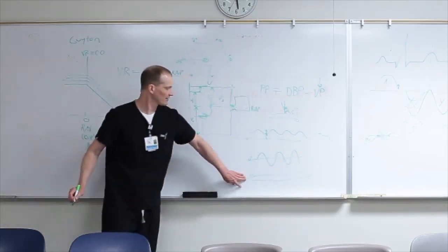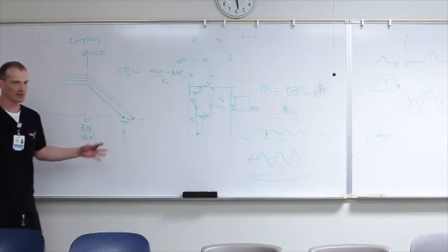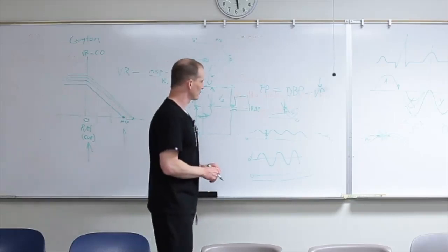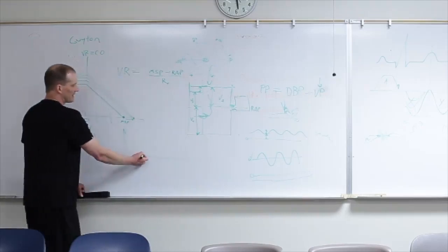This is your cirrhotics here and here, because the portal pressures are so high. The liver just oozes juice into the peritoneal cavity. And then real quick, as far as the renal stuff goes, the baseline is like this.